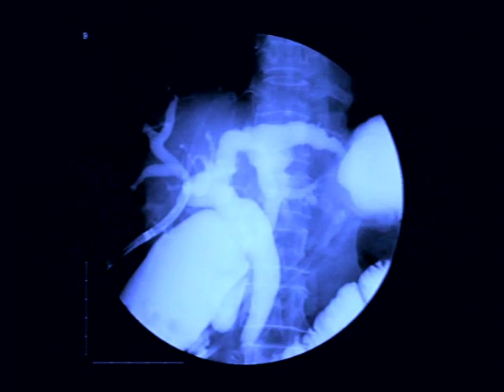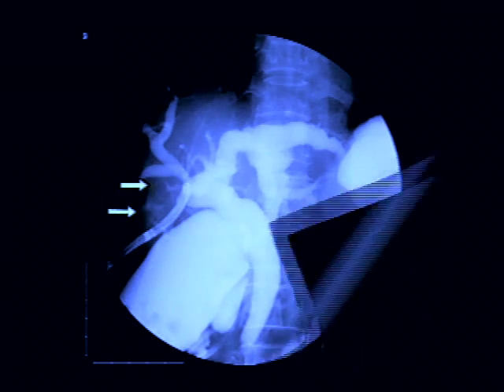In order to find out the missing duct, the tip of cholangioscope is located at the presumed origin site of right anterior segmental duct, and then forceful contrast injection was done. Now the missing duct is faintly delineated. Careful review of imaging studies and three-dimensional understanding of segmental ductal anatomy is an essential step for complete removal of intrahepatic stones.